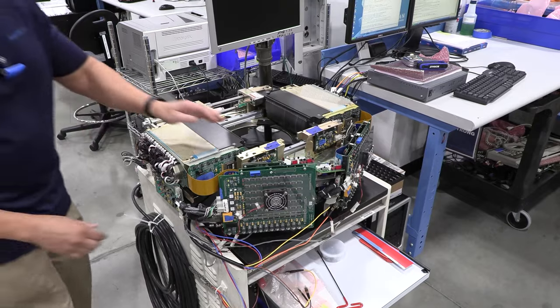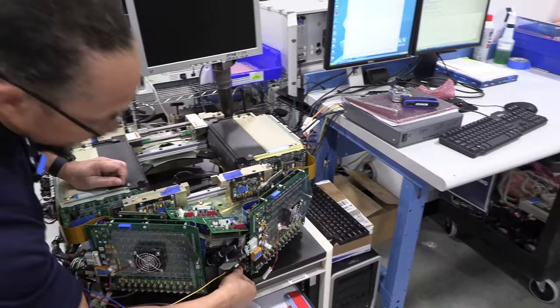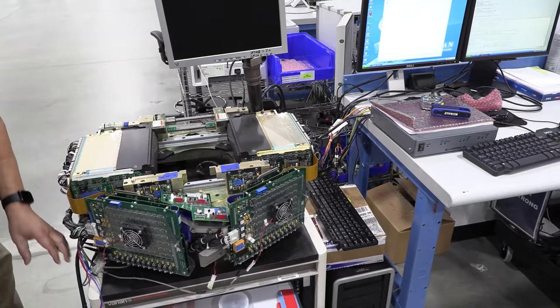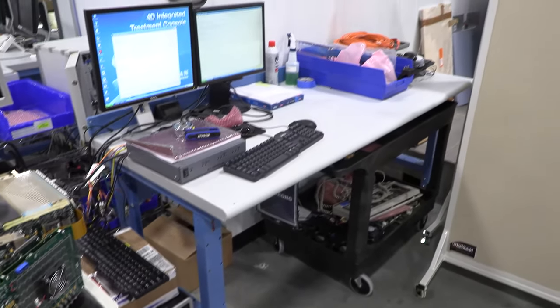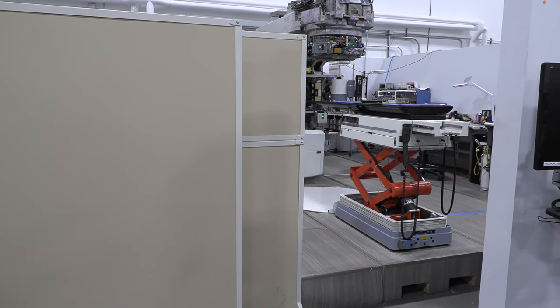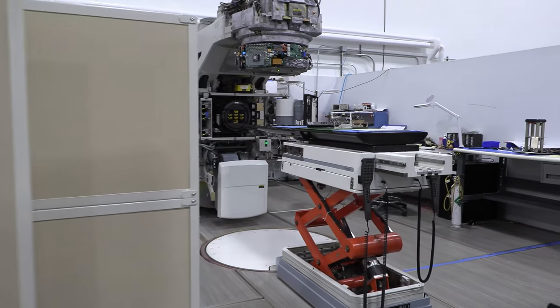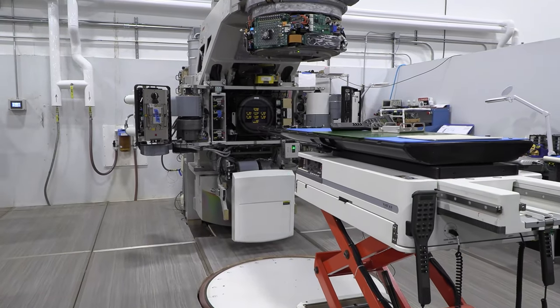This is actually a test bench. Yes, it is. It's amazing. There are different software versions here, as you can see, so we can test different software versions. Really? Yeah, basically anything 6.8 and lower is one set, and above 6.8 is different. Depending on what boards we have to use, a different computer or different software tests them. So basically that is what goes on the head right there, you can see. Right. And as you can tell, it's a lot easier to work out here than it is on that. Oh, completely. That is so cool.